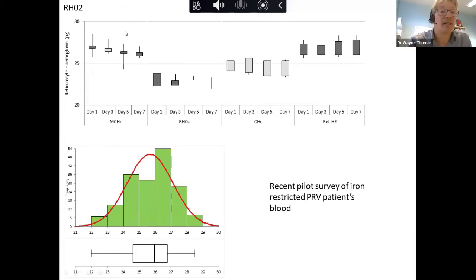Not only that, you can see that over a period of days, day 1, day 3, day 5, up to day 7, it stays pretty stable. So it's saying the same thing on day 7 as it is on day 1. Now, if you're going to do a QC scheme, you don't really want it to change if it takes, say, 3 days to get to you versus it taking 1 day to get to you. So it's going to say the same thing. So that's quite exciting, really.